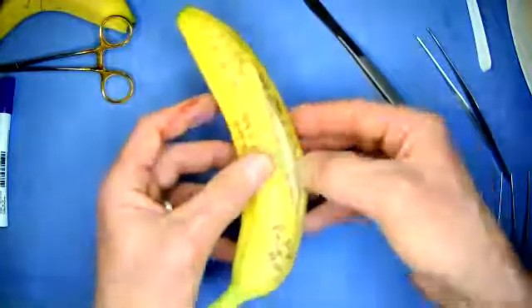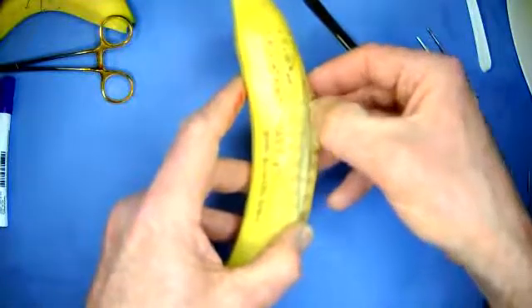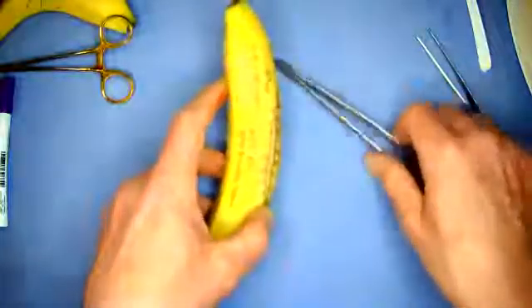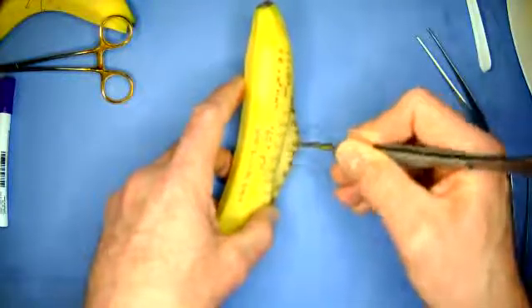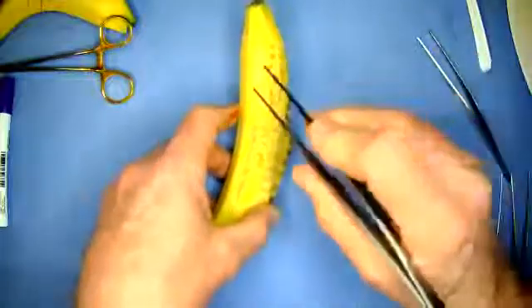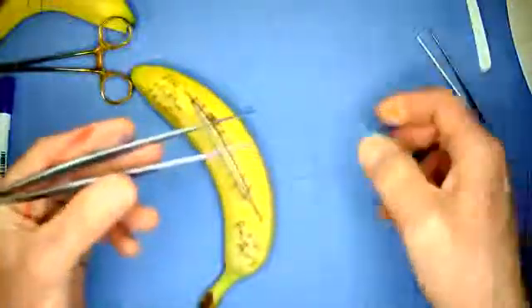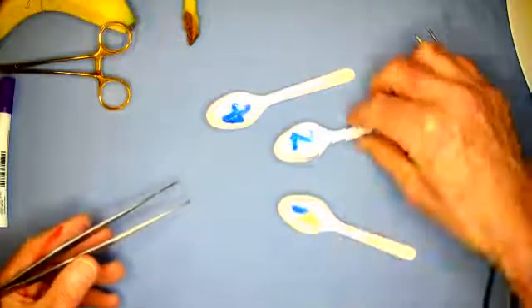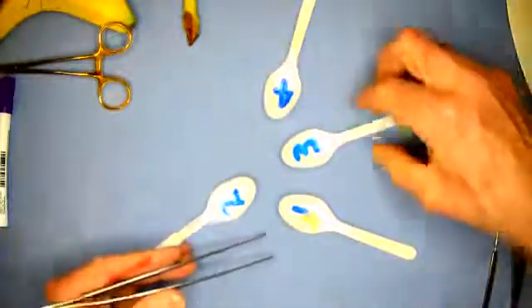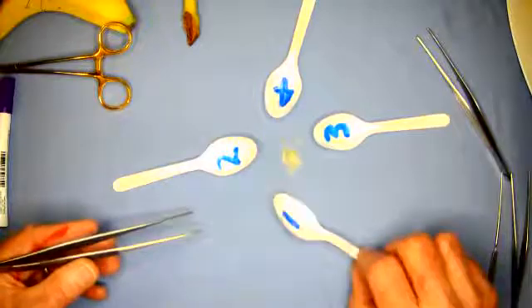So it's not surprising when you actually look at this, the inside is squashed and it's full thickness as well. And there are plenty of studies showing that the mucosa is damaged, and bowel is damaged, and certainly if you instrument the inside of a vessel, then that's the intima, and you can see simply rubbing it, the intima of the vessel is actually damaged as well. So forceps incorrectly used with inappropriate pressure will result in damage to the tissue. So please lighten up. And remember, what you've got in your hand is a lethal weapon that is halfway to cracking concrete.